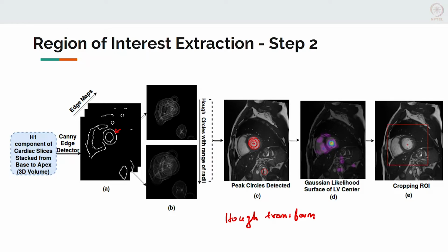Again, you have to look this up, we are not going to go through all of these techniques because it is not an image processing course. The Hough transform helps detect circles. This is the circular transform that you are using, it helps detect circles in images. Typically, if you have a black and white image like the one we have generated here, you can use it to automatically detect circles. Now, if you are wondering why that is so important, just think about how you would actually detect a circle in an image. It is actually a non-trivial problem to do.